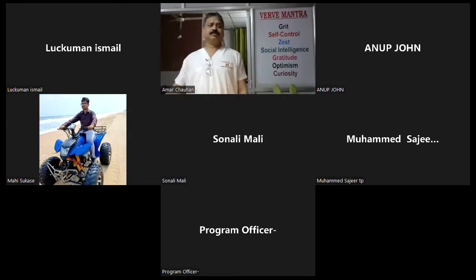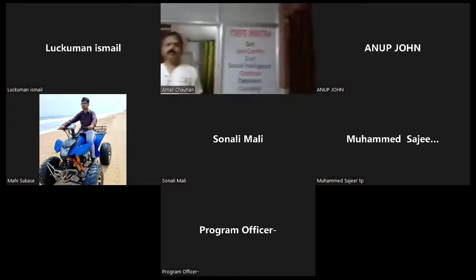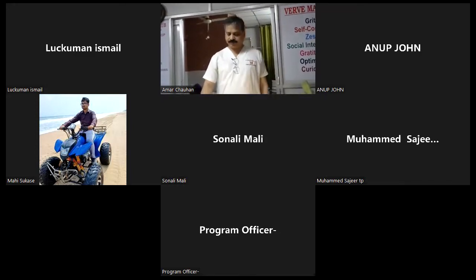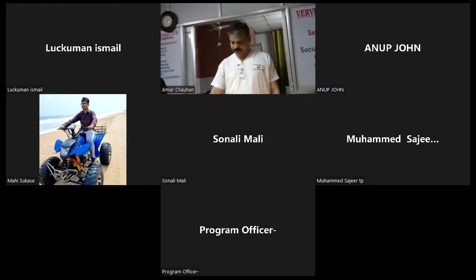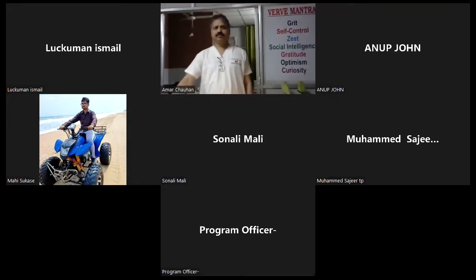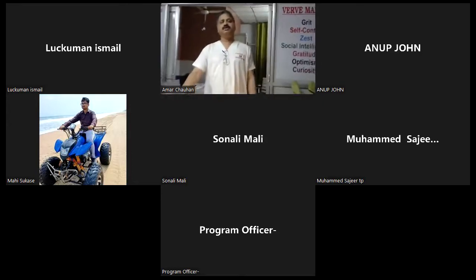Okay, fine. So bubbling in underwater seal drainage after ICD insertion, that you have already shown. Yeah, you have seen it in the back, bubbling up. Okay, got it. Tension pneumothorax on the right side, electronically created. So multiple punctures for decompression, you can do thousands of them. So air escape, oozing sound as air escapes, air bubble in the 20 ml syringe. Both the oozing sound and the bubble in the syringe also.